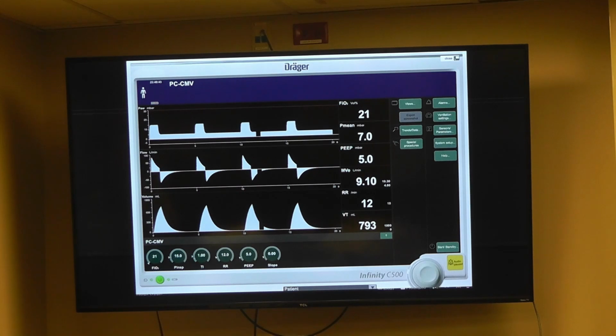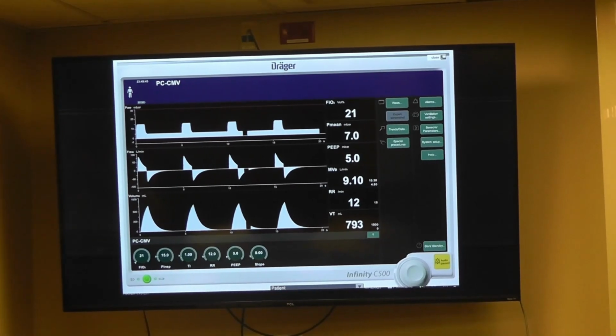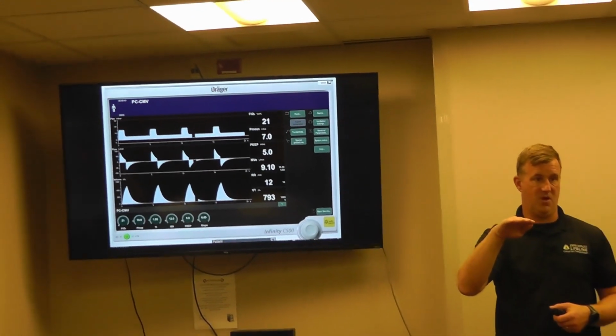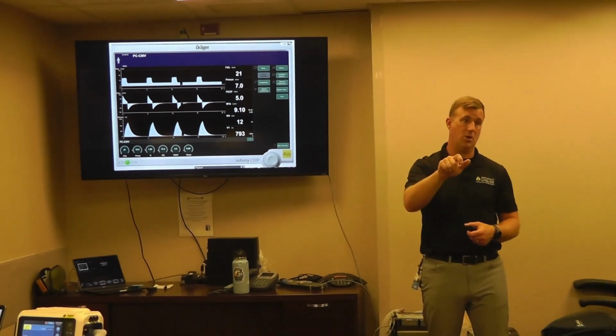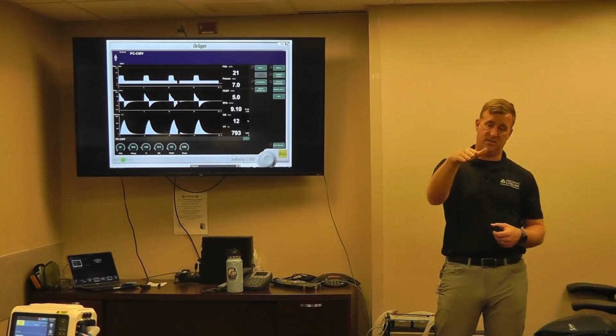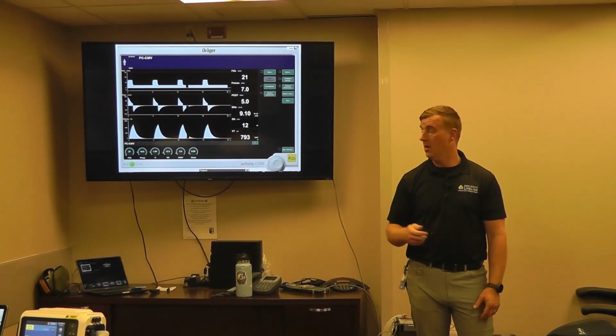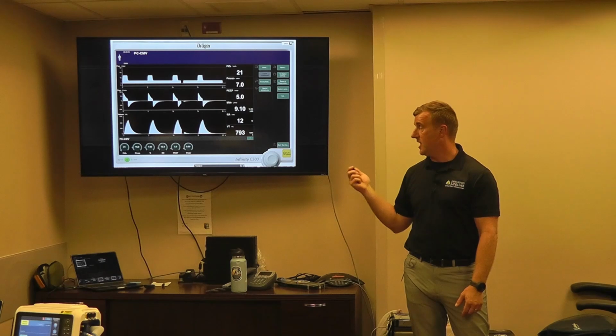Okay? So I want you to think about this as you've got a jug, right? You put it under your kitchen faucet. Say it's a gallon jug. I want to fill that up. I'm going to open my faucet wide open, okay? I don't know how long that's going to take necessarily. So I have to stand there, and when I get to the top of the jug, I shut it off, right? Doesn't shut off completely. At least my faucet doesn't. It tails off as I close it, right? So that's that slowing down, but I still want to fill up that jug. Make sense? Okay. And this will make more sense when we talk about volume. So that's how we do pressure.